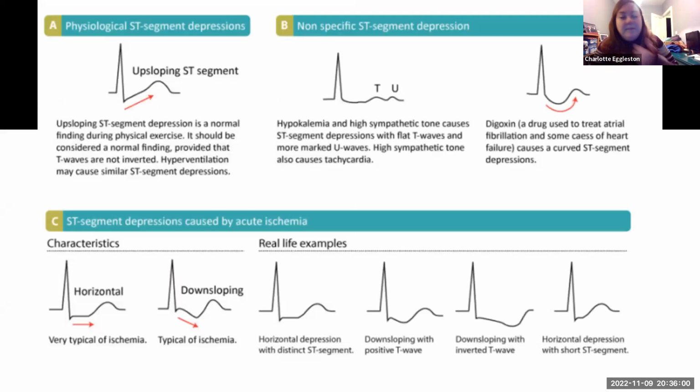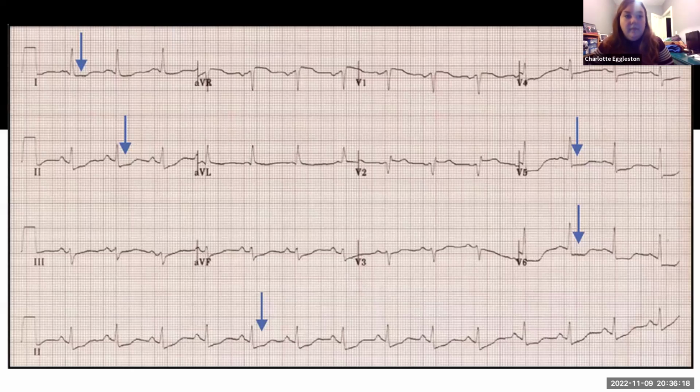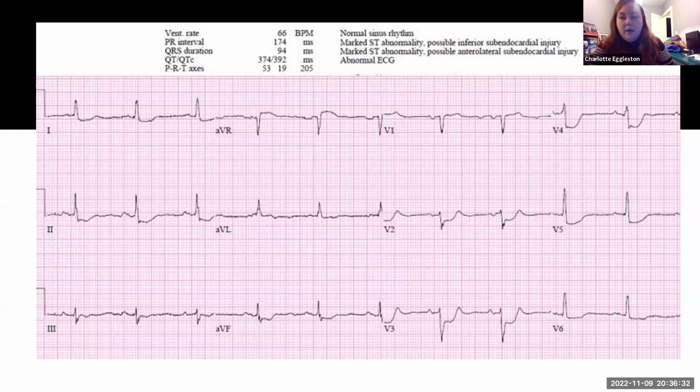And again, it's not always beautifully shaped as if you were designing an ECG yourself. So some of these images aren't brilliant. Sometimes it's a bit more sloped or a bit more flat, but basically you're going to be looking for those, get that piece of paper and check compared to the baseline. And some helpful arrows, which is nice when they include those, but you can see that ST depression. Again, if I see ST depression, I'm always going to check for ST elevation in the opposite leads, which I can't see on here. That's a slightly more obvious ST depression on that one.